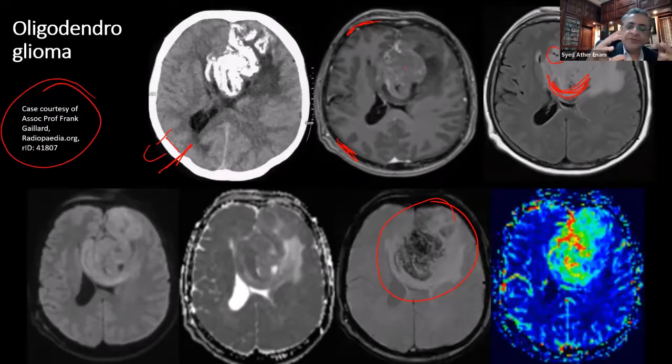In those areas where there's a lot of fluid, the water molecules are moving around based on Brownian motion. Whenever they are excited in a certain phase and then let go, as I showed you in the pictures, they give the radio frequency signal, but in that time they might have moved somewhere else, and then exciting again will do something different, right?